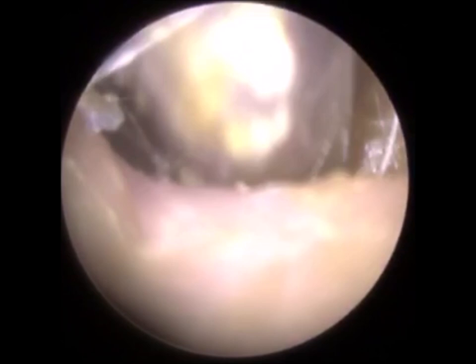When I'm out of the ear, I'm just either cleaning the instrument, wiping the tip of the endoscope, or either myself or the client just wanted a little break. You can just see me there wiping the distal end with an alcohol wipe just to make the view clearer. Hopefully this is the only part where I have forgotten to edit, and I think the rest of the video I have edited out all the black segments. I do apologize for that. So again, just trying to remove another layer of this keratin from that crater, that cave, on the mastoid area of the ear canal.